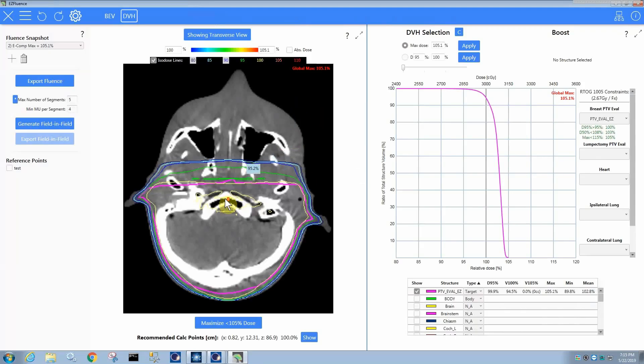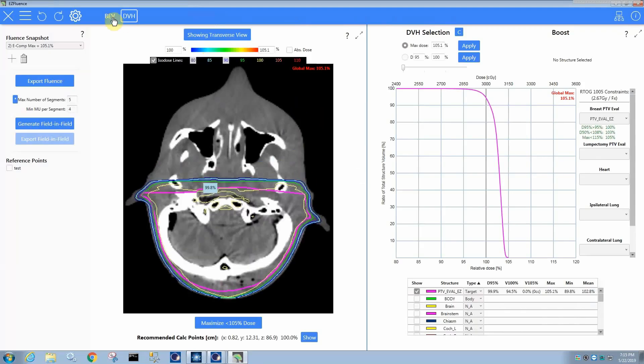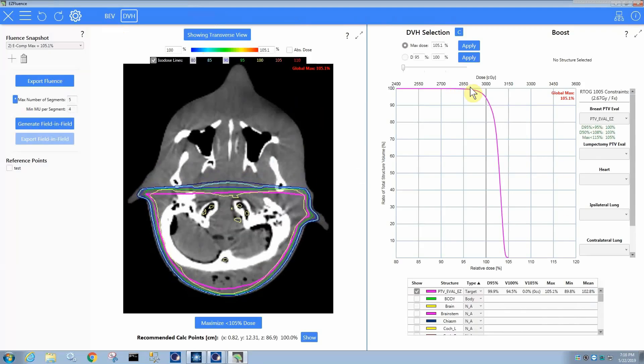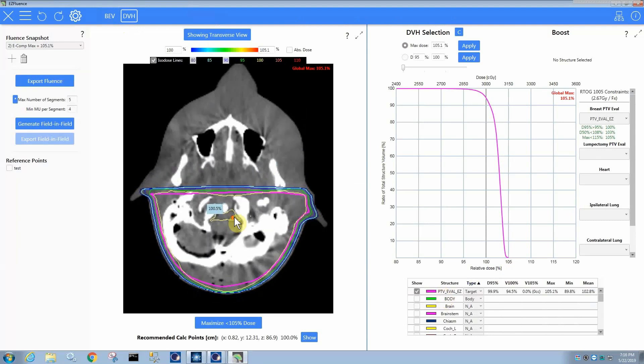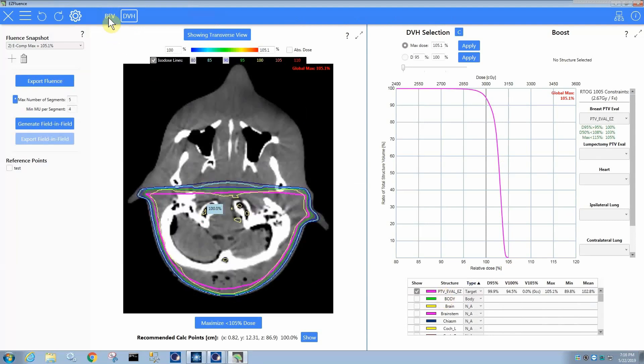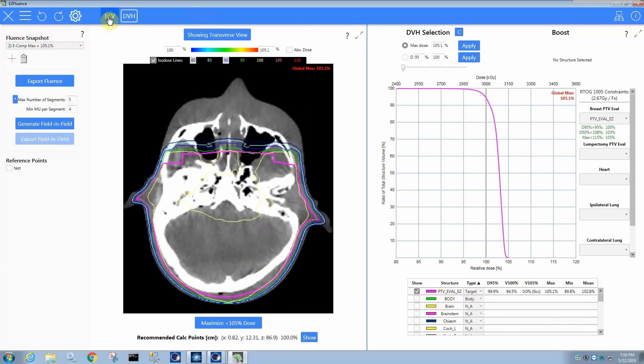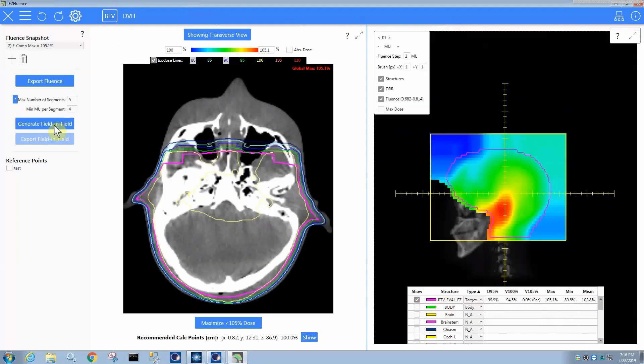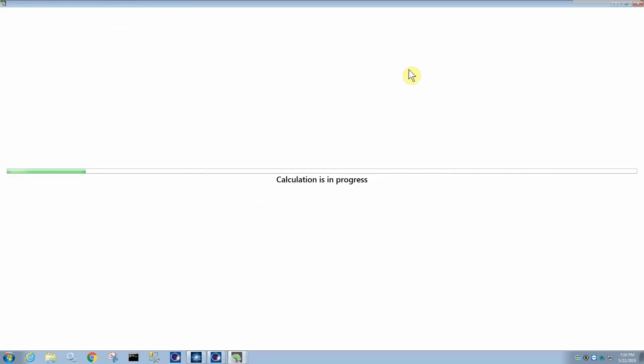And so when you produce this output, you have the option, of course, it's going to produce your DVH for the PTV eval EZ structure that it automatically contours, and you then of course can generate a field-in-field.